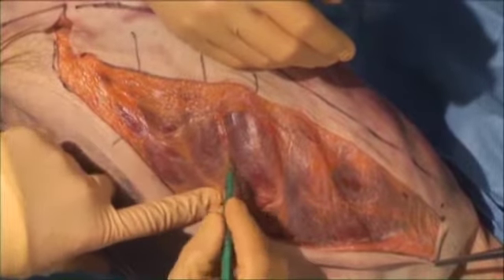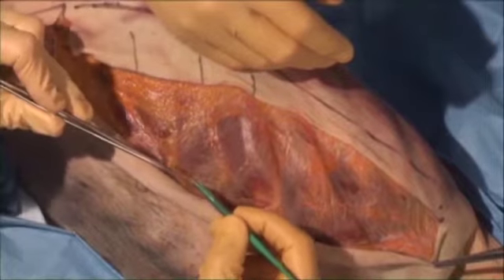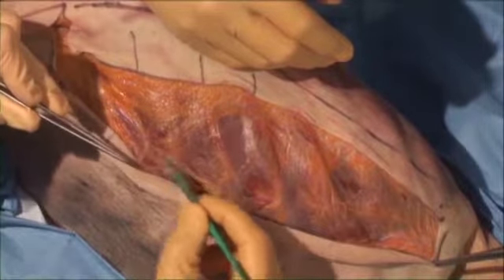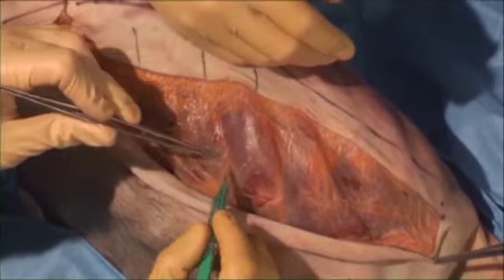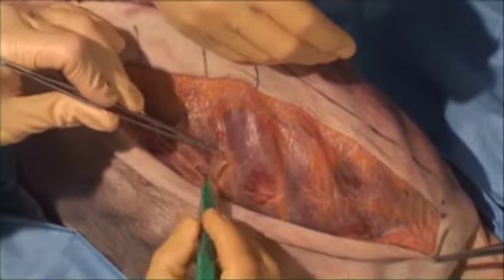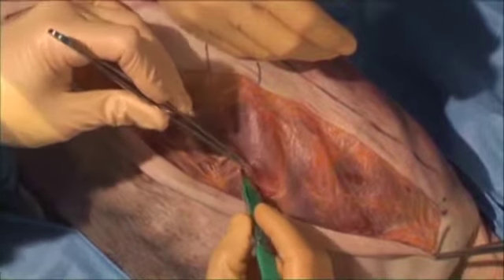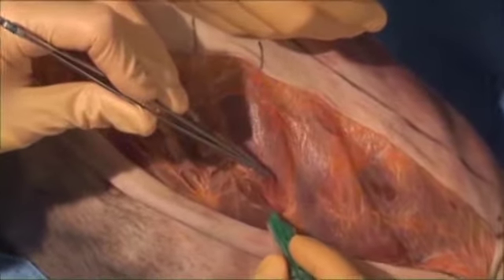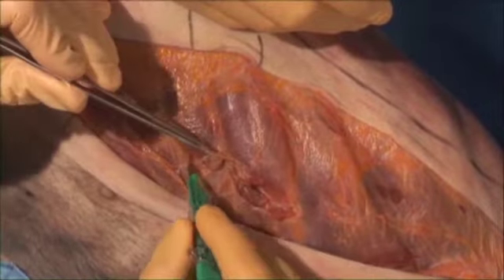Once you've identified the slips of the serratus, then you can work back from anterior to posterior and elevate them off as one unit, off the chest cavity. You got a cob or an elevator or something like that.